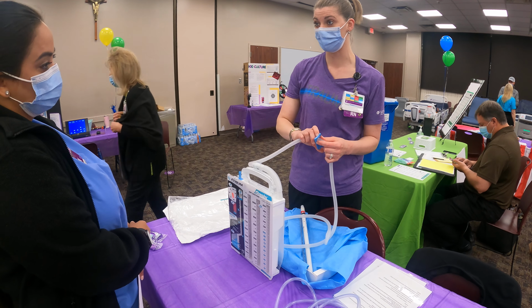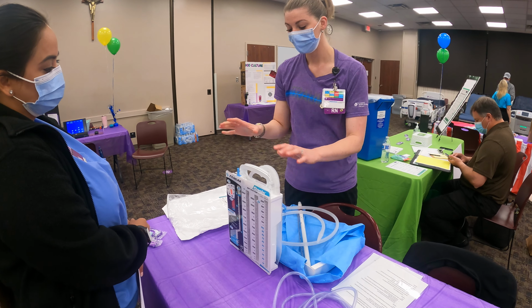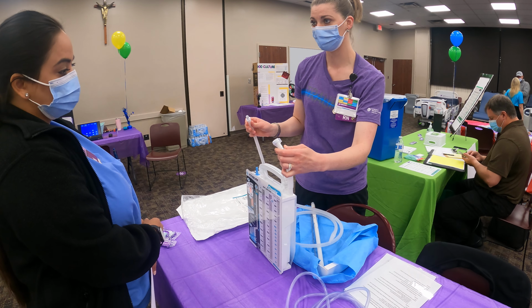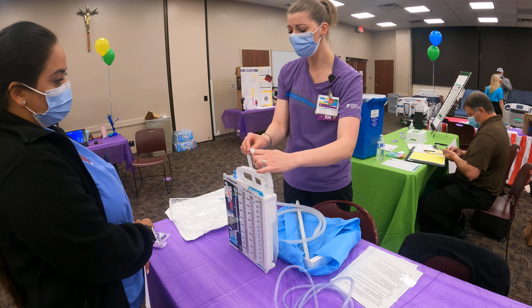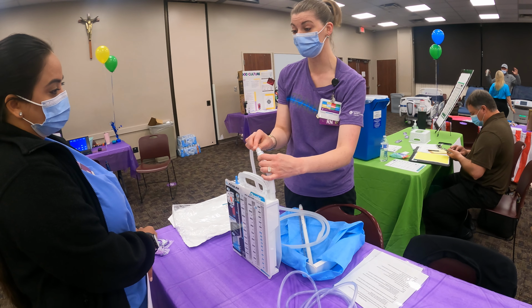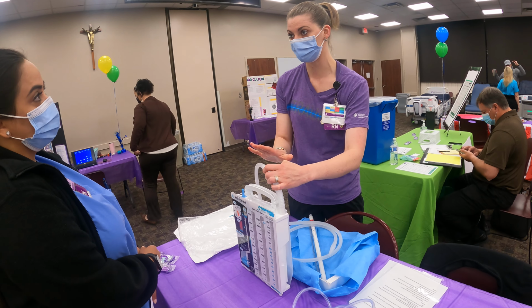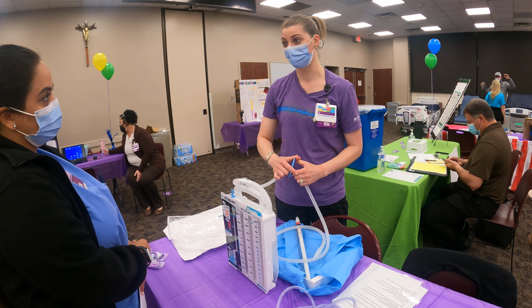This is the only time for a trauma patient that you'll ever clamp a chest tube. You clamp it. You get out your new atria that is in this container right here. You depress and you pull. This is still attached to your patient. You get out your new atria and you reconnect. Do not touch the inside of this because this is going inside the chest wall and it's sterile in there. You don't have to wear sterile gloves, but you have to make sure that you maintain sterile. And then you want to unclamp, and then you're good to go.